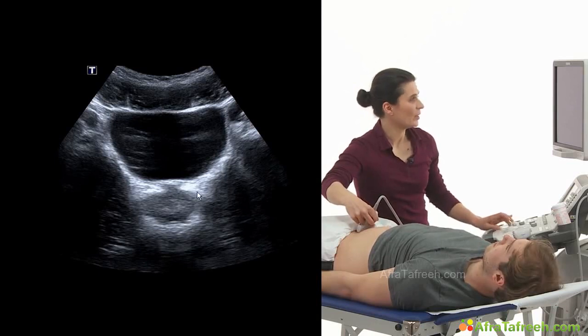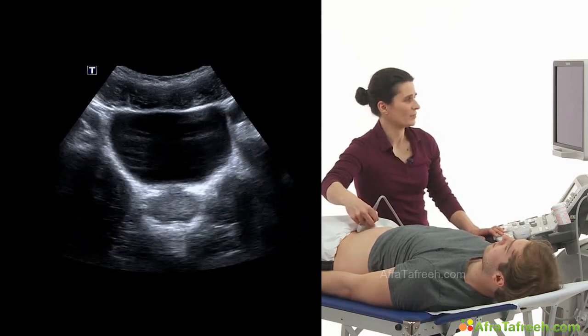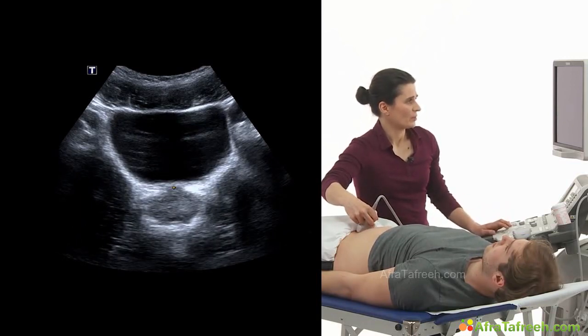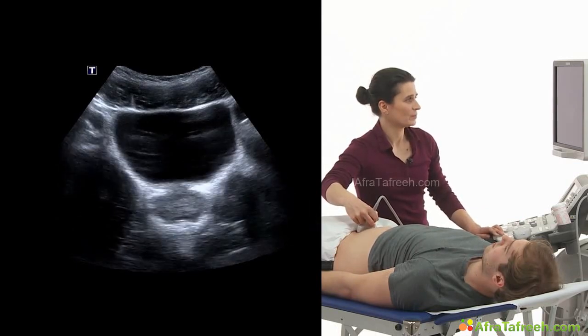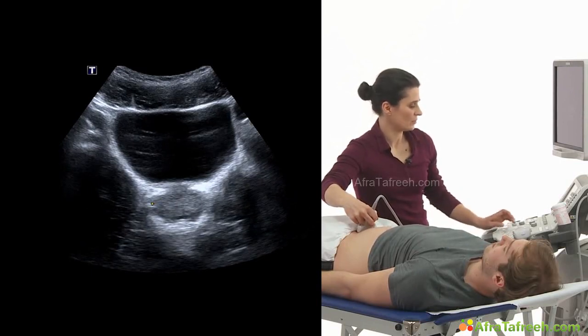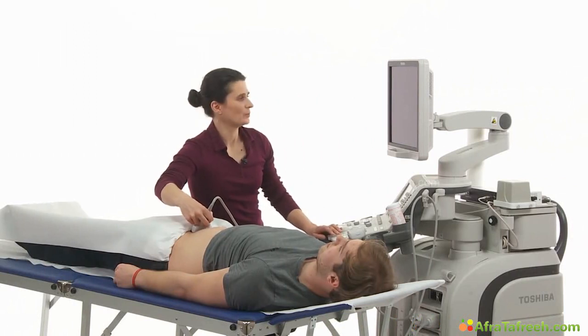Important is to assess if the border between the urinary bladder and the prostate is intact, and to measure the size. We can measure the ventral dorsal diameter, which should be under 3 centimeters. Here we got 2.6 centimeters, which is normal. And the next diameter is the transverse one, which should be under 5 centimeters. We got 3.6 centimeters here, which is quite normal.